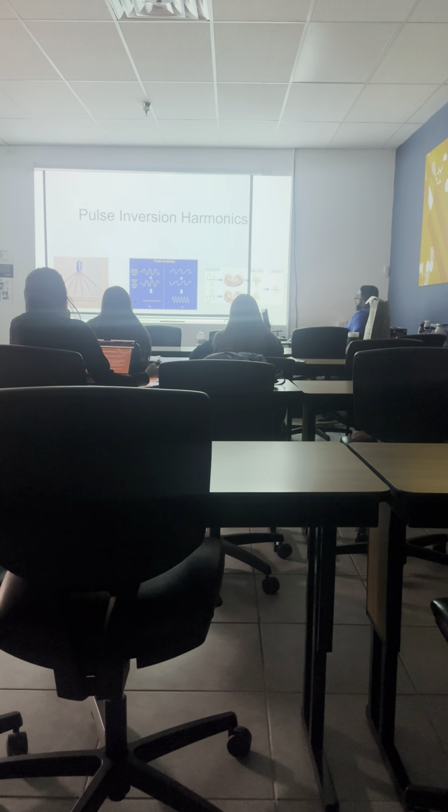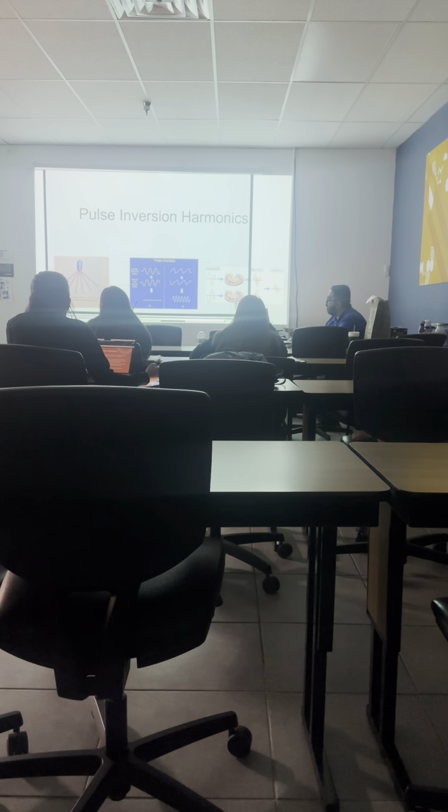Okay, so again, you see here it's sending out two pulses, right? It's sending out two pulses per scan line. This is the fundamental frequency. You can see that it's inverse, right?